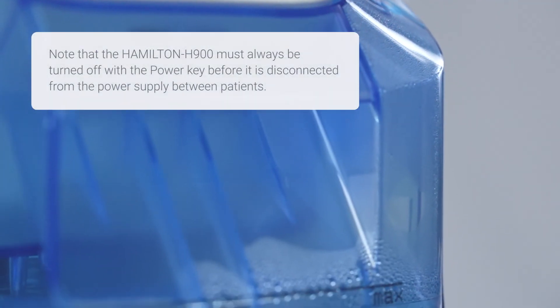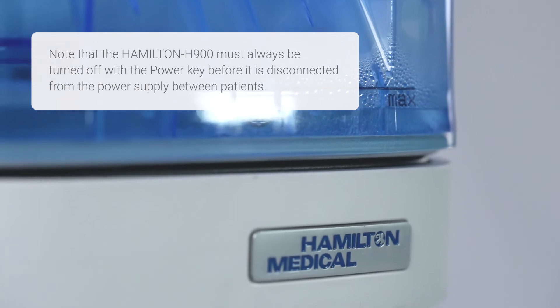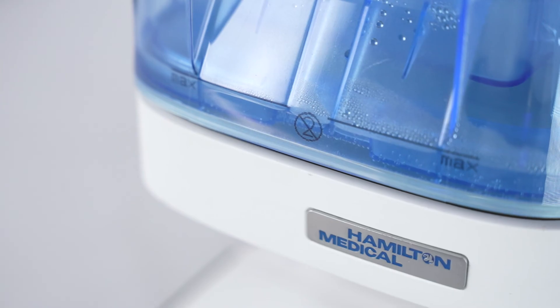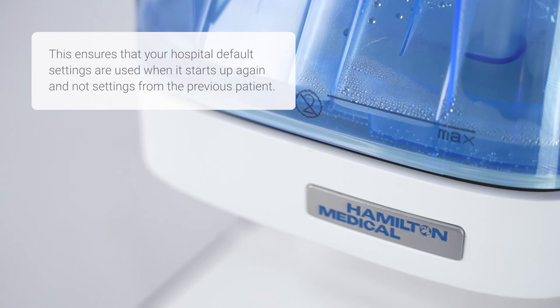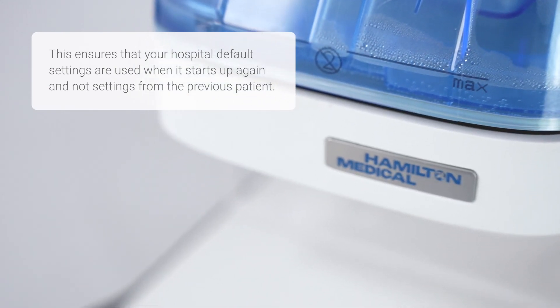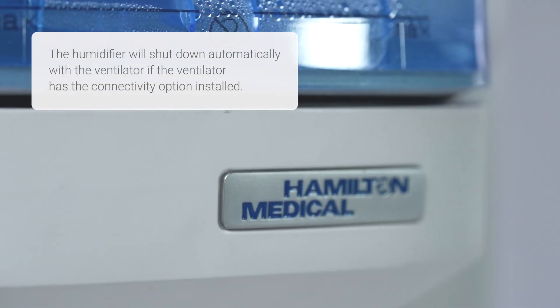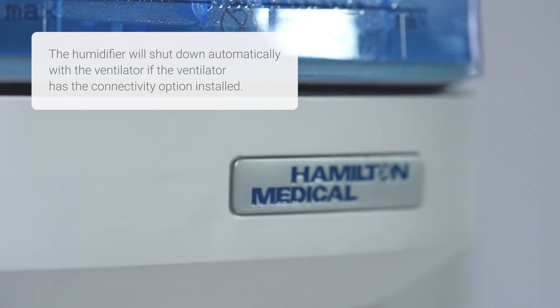Note that the Hamilton H900 must always be turned off with the power key before it is disconnected from the power supply between patients. This ensures that your hospital default settings are used when it starts up again and not the settings from the previous patient. The humidifier will shut down automatically with the ventilator if the ventilator has the connectivity option installed.